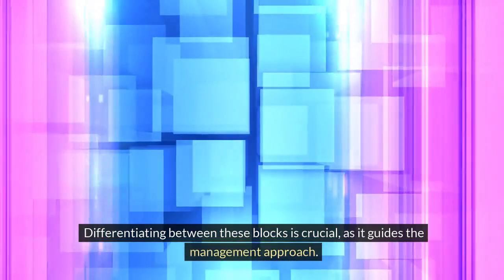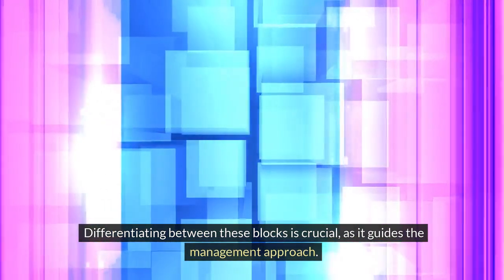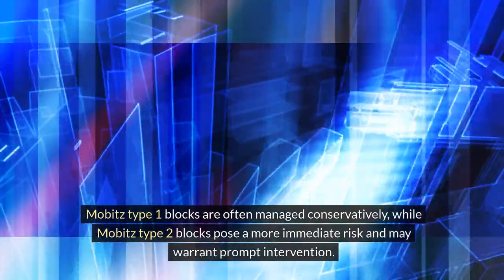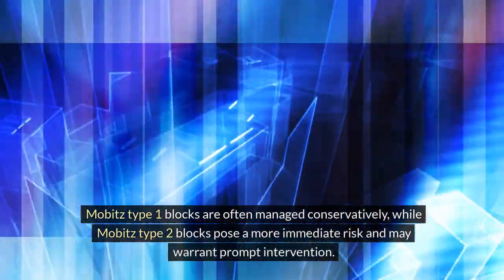Differentiating between these blocks is crucial, as it guides the management approach. Mobitz type 1 blocks are often managed conservatively, while Mobitz type 2 blocks pose a more immediate risk and may warrant prompt intervention.